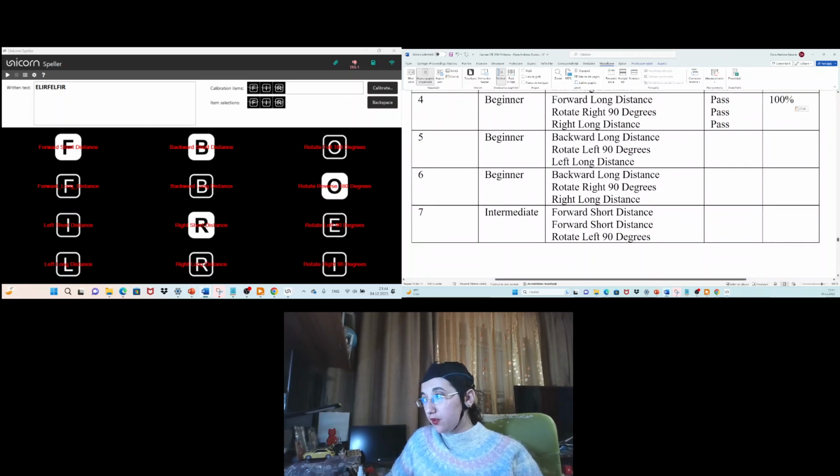So you can see that the experiment is still in progress, but we have all the best results. Then continue backward long distance, this one, then rotate left 90 degrees, this one, then left long distance.